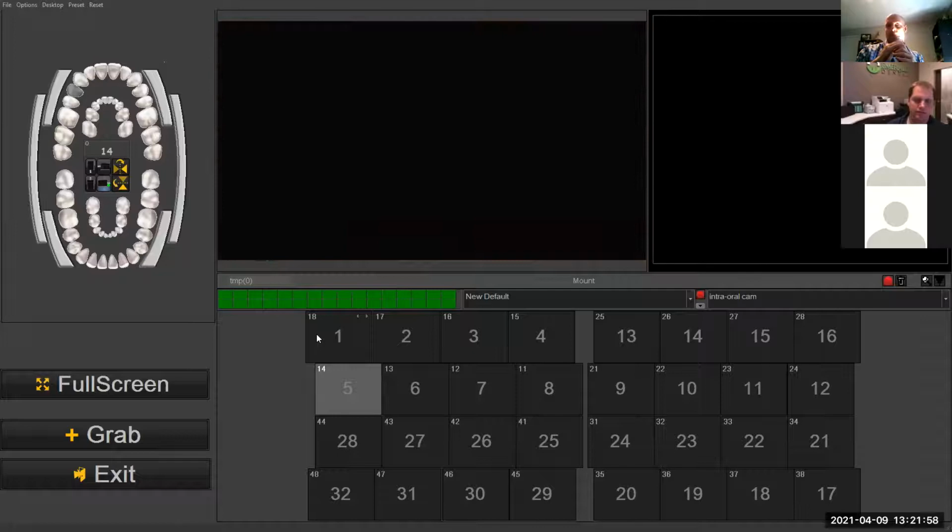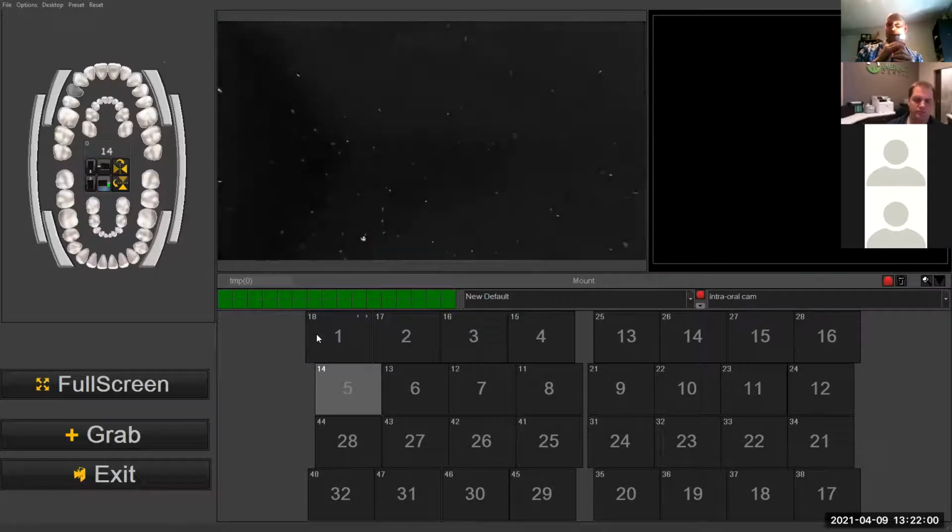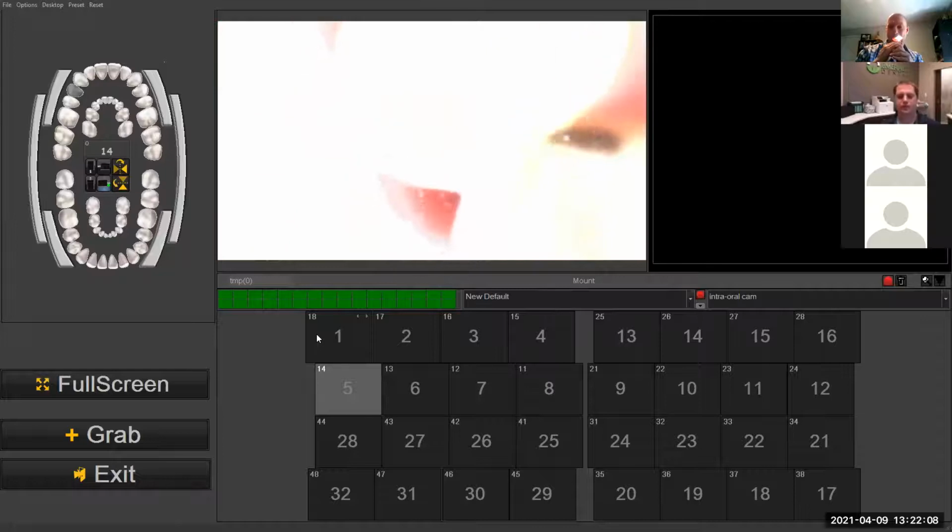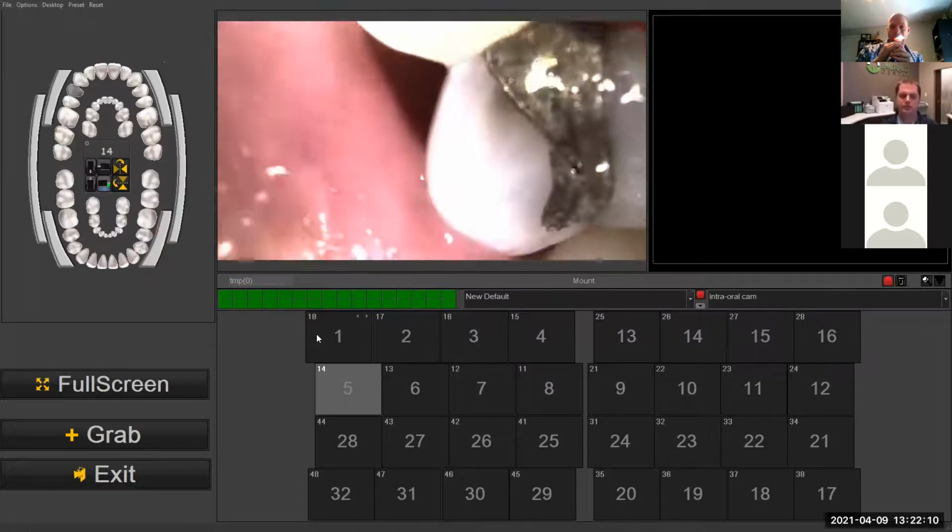No, this is a camera I have in my house that I've had for a while. This is not the camera that they have, but I've tested the camera that they have, and it does work with this system. Yeah, I know it's got a mouse integrated with it.